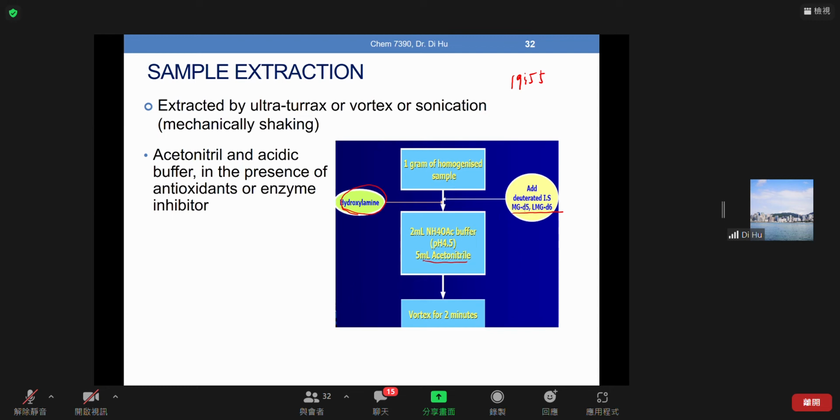Because it's just replacing hydrogen by deuterium. So that's D5, 5 hydrogens have been replaced. D6, 6 hydrogens have been replaced. So that would be the original molecular weight plus 5, and this one the original molecular weight plus 6, right? So the reason for using this isotope labeled internal standard in mass spectrometer is to account for things. You see that it's added at the very beginning, before the sample extraction, okay?